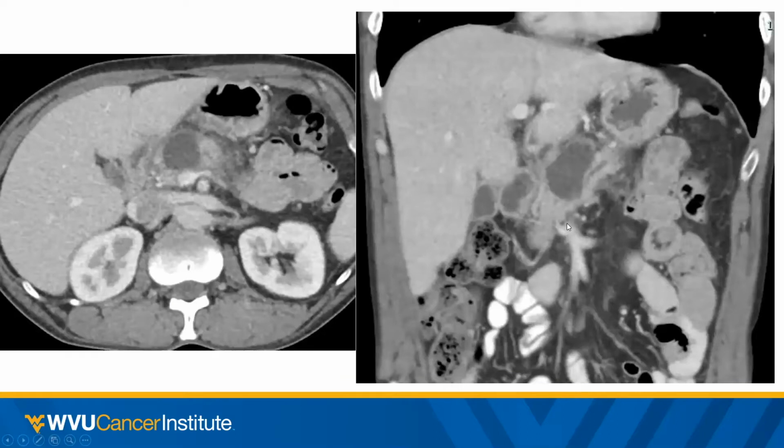And so here are some CT images from a classic appearance of a pancreatic pseudocyst, where we can see first and foremost some residual stranding along the pancreas, which we've included here to indicate a recent episode of pancreatitis. And then in association, we have this very well circumscribed fluid density cystic lesion at the level of the pancreatic neck, which is a classic appearance for a pseudocyst as a sequela of recent pancreatitis.